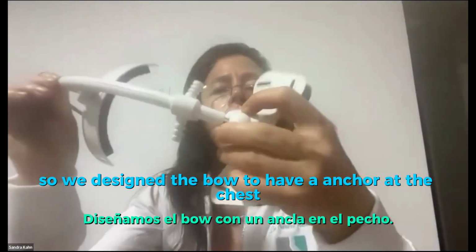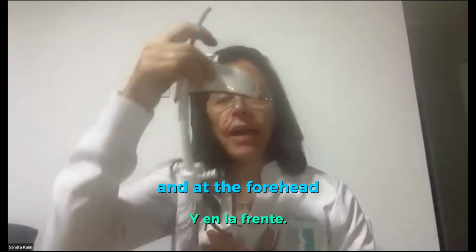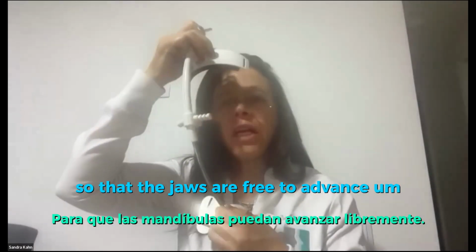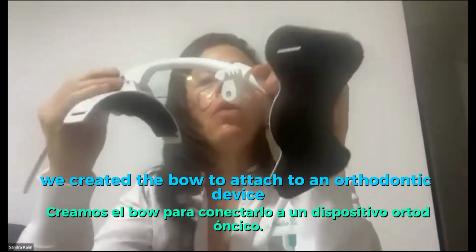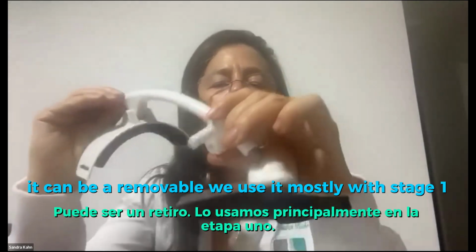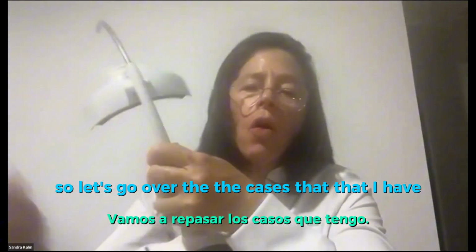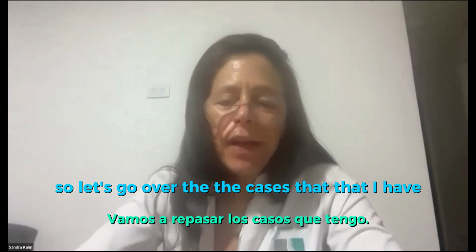So we designed the bow to have an anchor at the chest and at the forehead so that the jaws are free to advance. We created the bow to attach to an orthodontic device, ideally an orthopedic expander. It can be a fixed expander. It can be a removable. We use it mostly with stage 1. So let's go over the cases that I have.